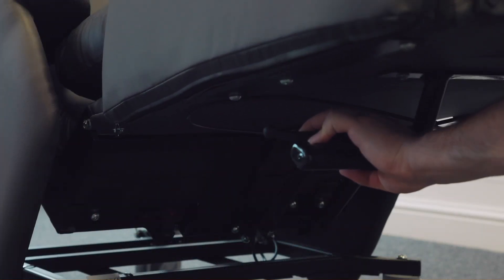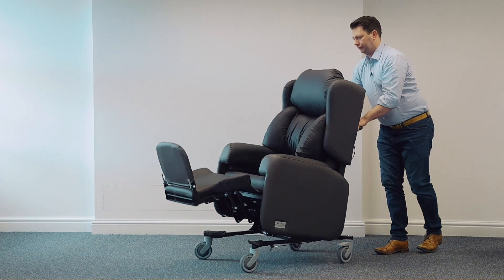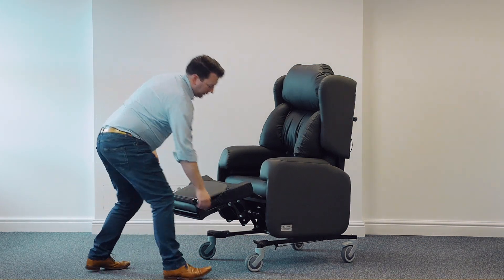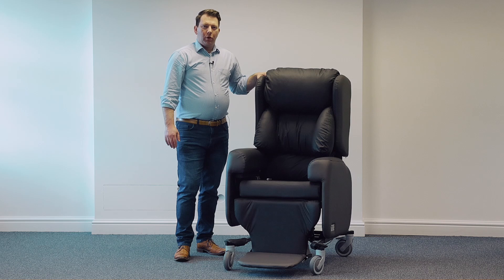the chair to adjust the backrest angle. This is to tailor it to the patient's comfort. To take the leg rest back down, squeeze the lever and push the leg rest under the chair.